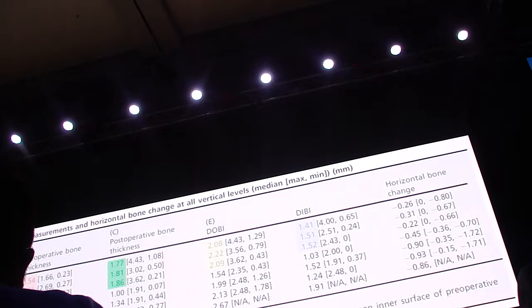They put in a bone graft. They filled the jumping distance. Unfortunately, you see where this has been published, Clinical Implant Research. It was not specified which implant system was used, and it was not specified which bone graft has been used. How can this go through an international review, not even mentioning what materials you used? Anyway, it's a good kind of research, but we're still lacking some knowledge there.